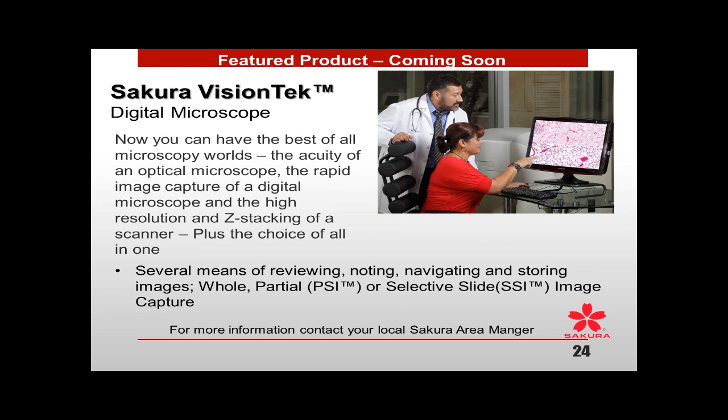My own experience with some of the 40X scans is that they can be 6 or more minutes for small areas if you want that kind of high definition. Thank you. And of course, every manufacturer will vary, and it depends on their software and how they've helped to manipulate the process.